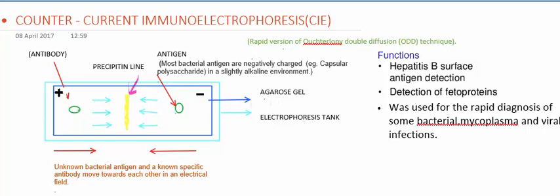Everyone, this is Suman, and today we are going to learn about a topic that is called counter current immunoelectrophoresis. It is a type of immunoelectrophoresis, but there is a modification.